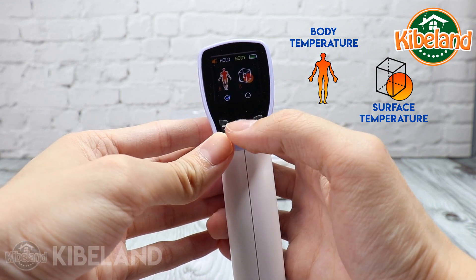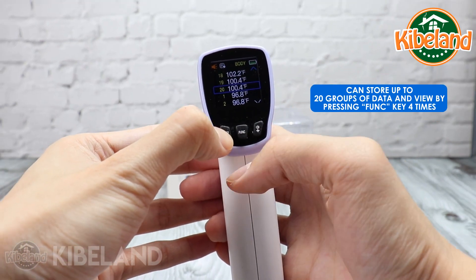To view the stored data, press the funk key four times. You can store up to 20 data points.